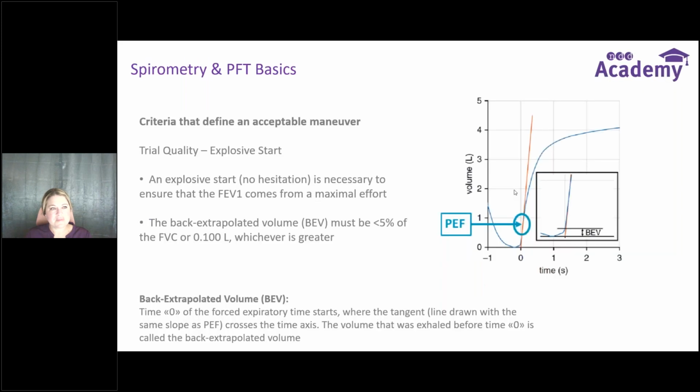Right? So we talked about what makes an acceptable trial, what makes these little green smiley faces green. And there's just a few different things that ATS ERS recognizes for a test to be acceptable. The first one in this trial quality is an explosive start.